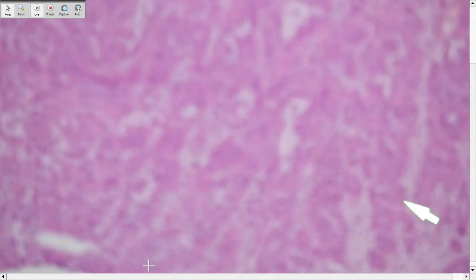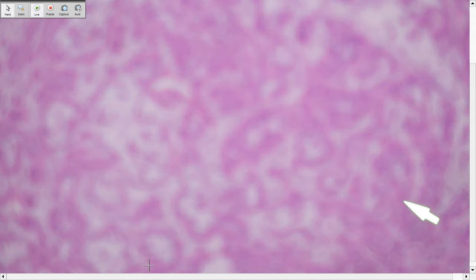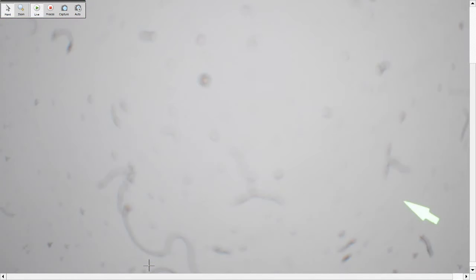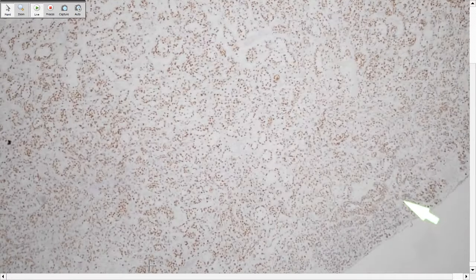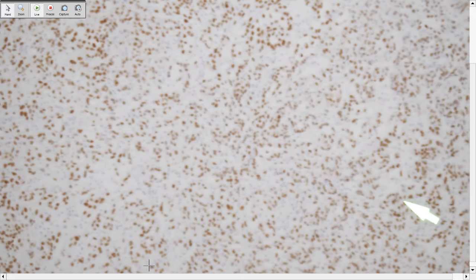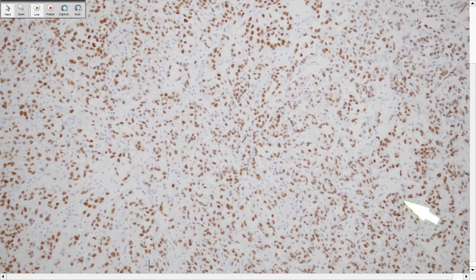What immunomarker would be helpful for this? Dr. Hans mentioned one: HNF1 beta, a hepatic nuclear factor, for clear cell. It's a very good one. These are good cases. I talked with Dr. Hans and said I don't have a slide to show. Luckily, Lily kept one slide from the tumor board, but I think Lily will show that.